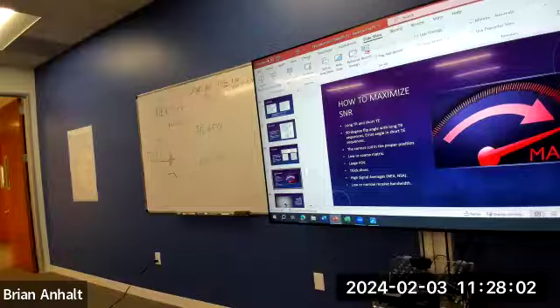It's focusing more. So when you decrease the bandwidth, you're focusing on more frequency and less noise. But if you're increasing it, you're getting the same amount of noise, so you're expanding it for more. That's lower bandwidth.